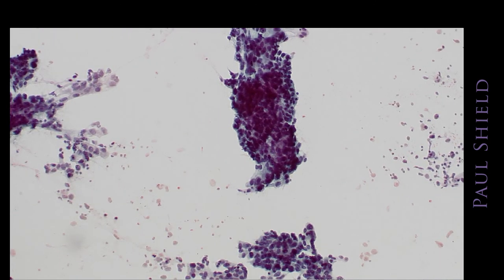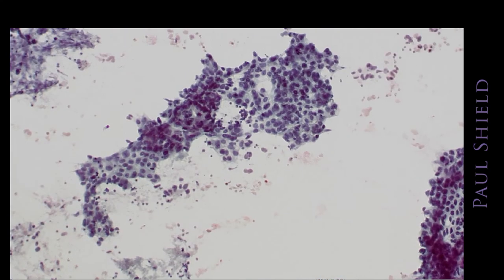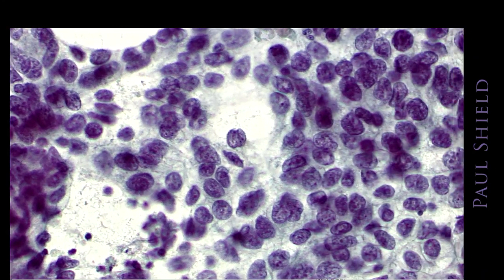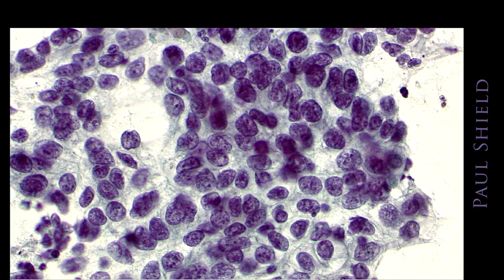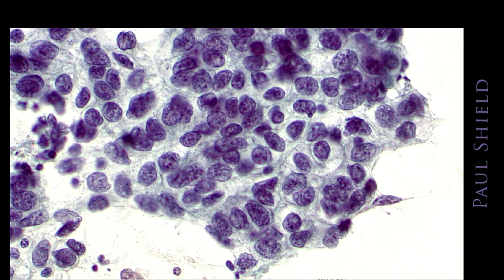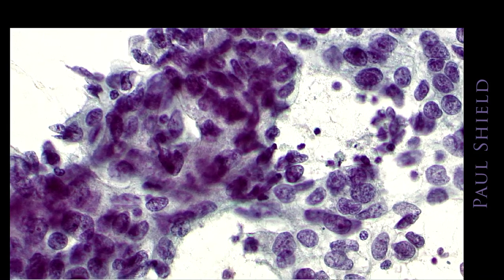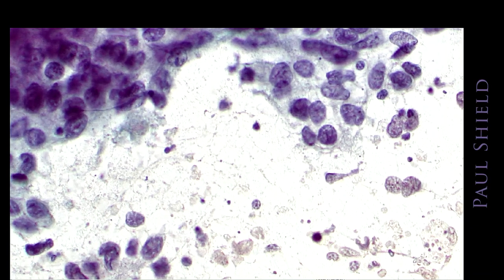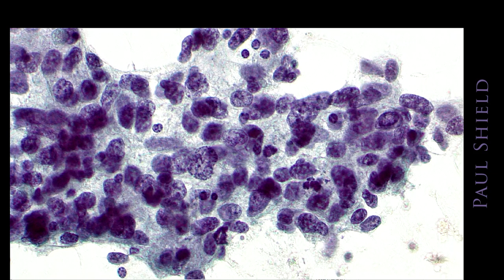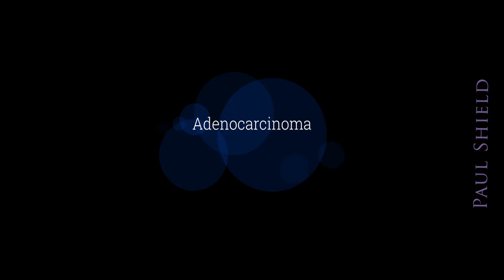We can tell that it is very hyperchromatic and abnormal, and there I've got like a crowded sheet of cells, and here you can see it's that very disorganized arrangement of adenocarcinoma. The cells are basically in like a crowded sheet. They have fairly granular vacuolated cytoplasm. Nucleoli aren't as prominent in this one, but there's obvious abnormal chromatin. And again, that sort of crowded sheet. Quite a lot of variation in size and shape.